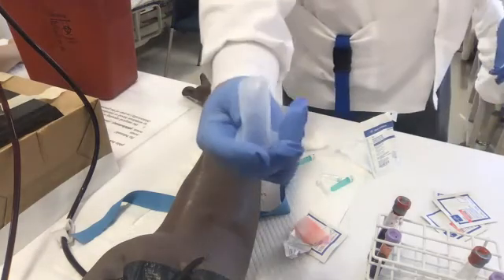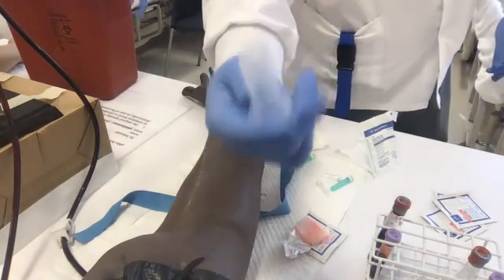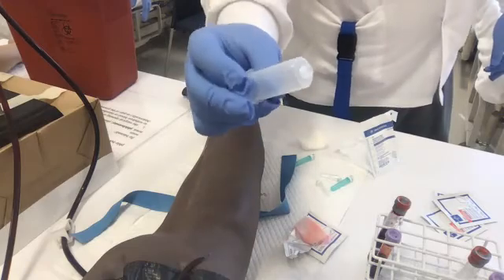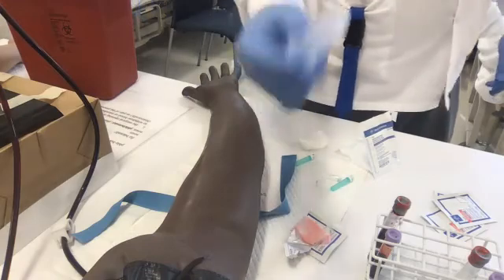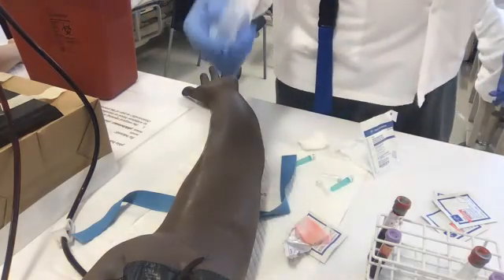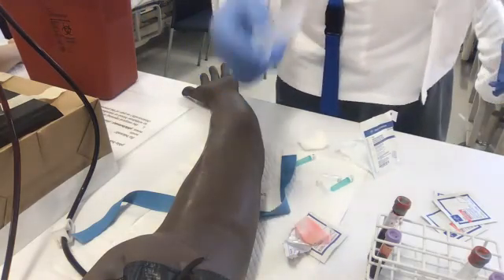I used to work as an MA for a very, very cheap doctor, and she made me use these barrels as much as I could. But nowadays, I just wanted to show you that. In real life, you discard these. But you might see it in a lot of old school people.